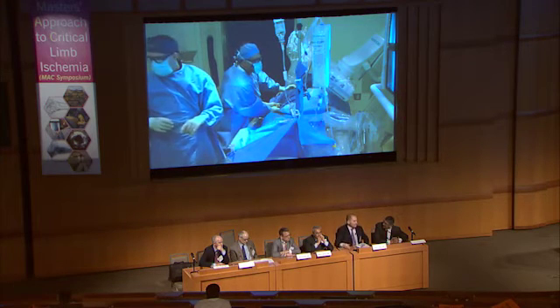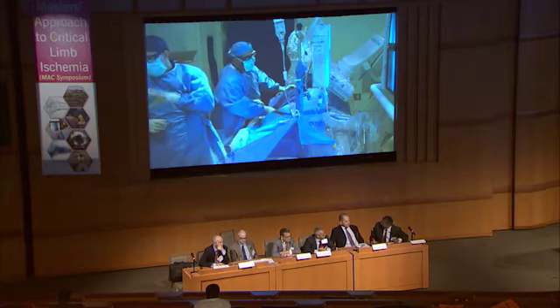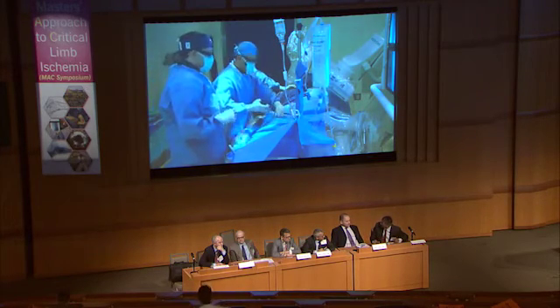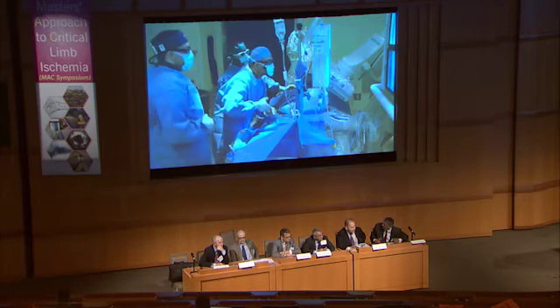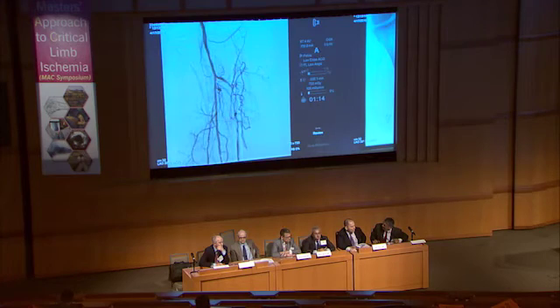And one follow-up question, and then we'll go to the panel. What would be the best way? So, selective angiography of the profunda? Because, seriously, I haven't dealt with this, so I can't comment. So your thoughts? Or are there other imaging modalities that could help identify the bigger feeders in this situation?